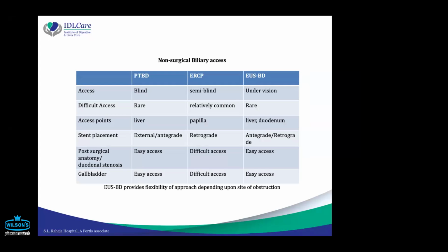So if we compare the three techniques, looking at the access, PTBD is by and large, most experts do it blind. It can be done under ultrasound guidance, but almost all experts that I know do it blind.